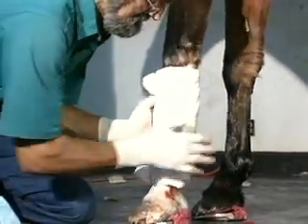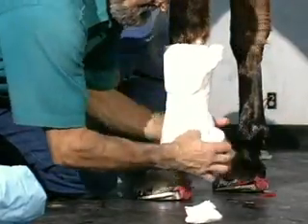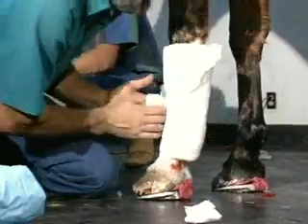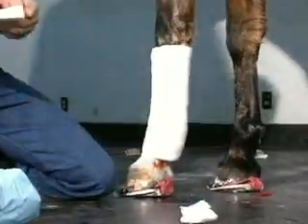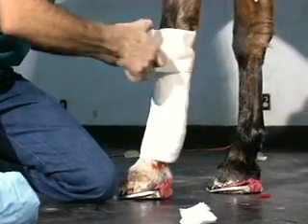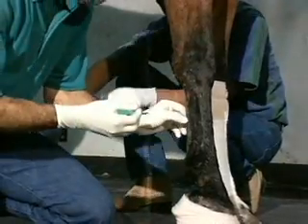I use a combine bandage. I like to keep my legs bandaged for approximately three months. I will change the first set of bandages in seven to ten days and remove the stitches. I want to use adequate cotton and put on a very firm vet wrap support. Using this technique, it's routine for the legs to be cosmetically acceptable. You'll be able to look at the legs post-op and tell that they've had a tenotomy if you know what you're looking for. Take the stretch out, lay it around — you can get two to three weeks out of a bandage change with no problem.